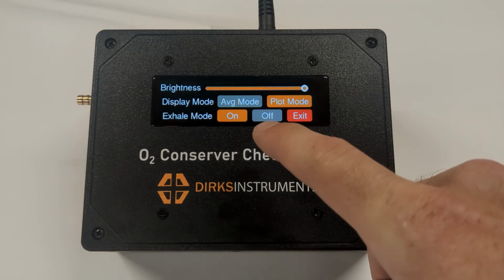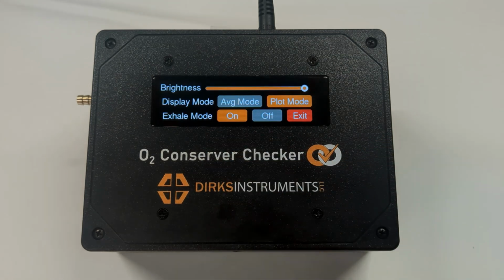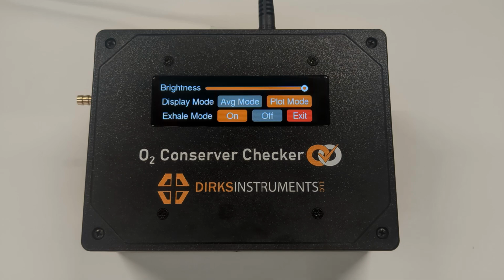For some devices, at breath rates above 30 breaths per minute, you may not be able to achieve the desired breath rate due to the length of the exhale pulse, as well as the length of the delivered pulse from the device. For these devices, you can turn the exhale mode off, and this will disable the positive exhale pressure and shorten the time between pulses. Each time you restart the device, it will start in average mode and with the exhale signal enabled.